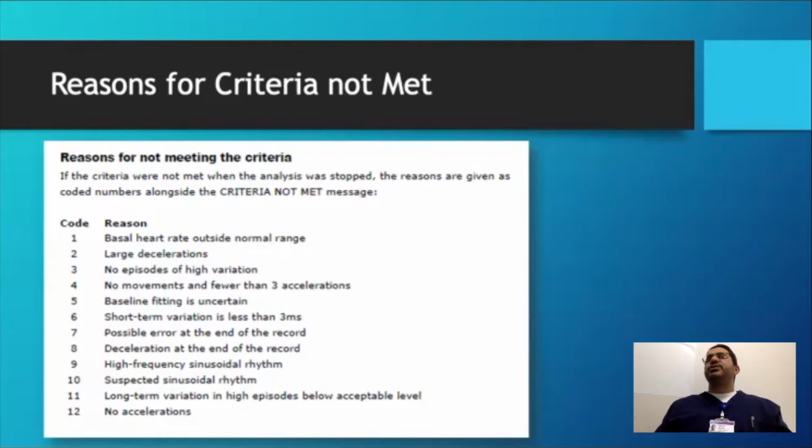So when we talk about lack of cycling, there are two very separate scenarios. You can see it in chronic hypoxia, but that's not what it actually means. What does lack of cycling mean? Baby's stuck in one of the phases, either completely asleep all the time or always awake. And those are obviously very different.